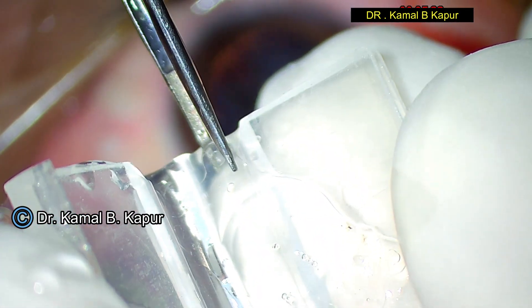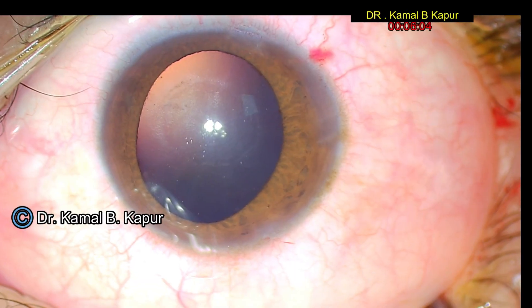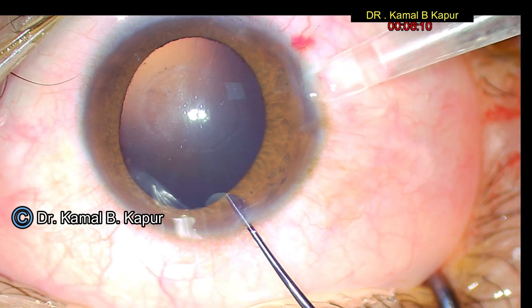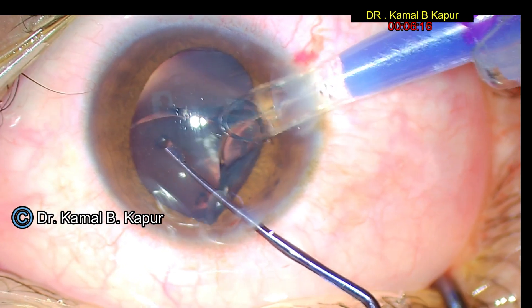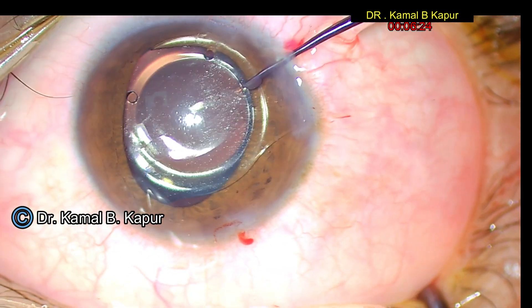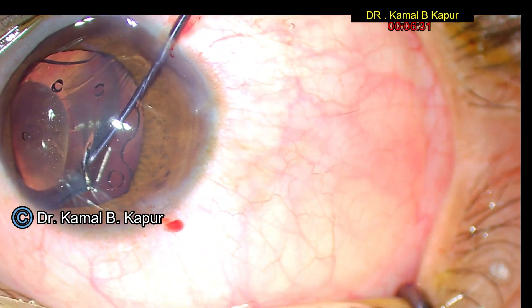We load the lens in the correct orientation and put it into the cartridge. Once the lens has been loaded in its place, we go ahead and implant the same phakic lens in the correct orientation, making sure that this time the alignment and orientation are correct.